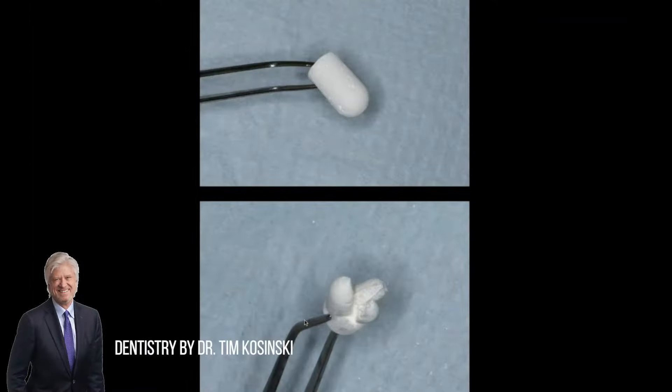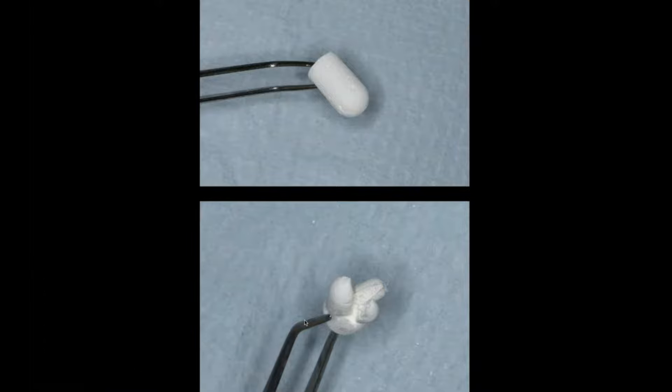Would that be something you'd be interested in? So this is what it looks like. It looks like a collagen plug, but it is not a collagen plug. Just remember that there's a lot of confusion out there on different products.